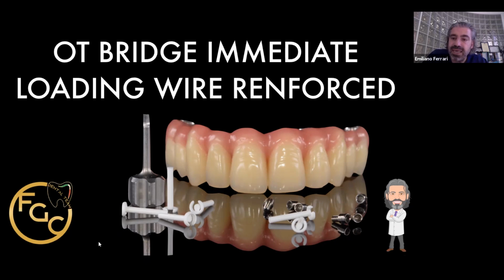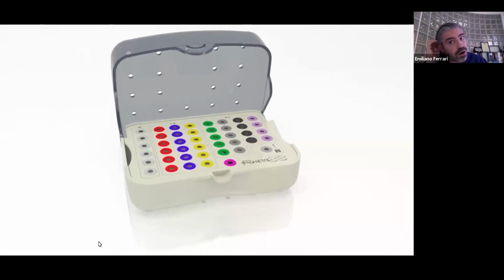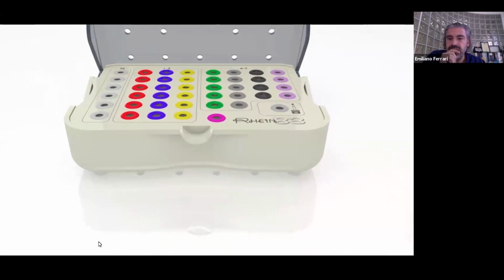So in this case, if you want to build maybe an immediate loading reinforced provisional, this way you can build it very easily and in a very fast way. So this is the video of how it works, and Gianni maybe can tell us.